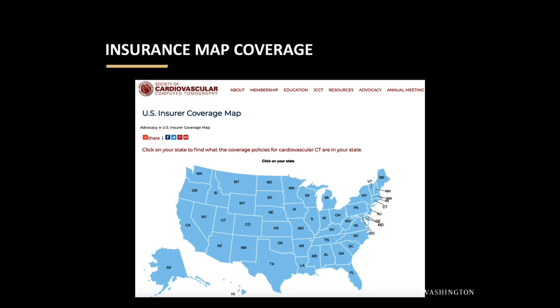But yeah, if someone has a normal or 0 calcium score, usually they say around 5 years is where the majority of people will start to show calcium and go from a 0 to a positive score. And if you're older, that's going to increase a little bit faster than if you're younger. And if you have calcium, they usually say every year there's a 20% increase or so in the level of calcium based off of that score.